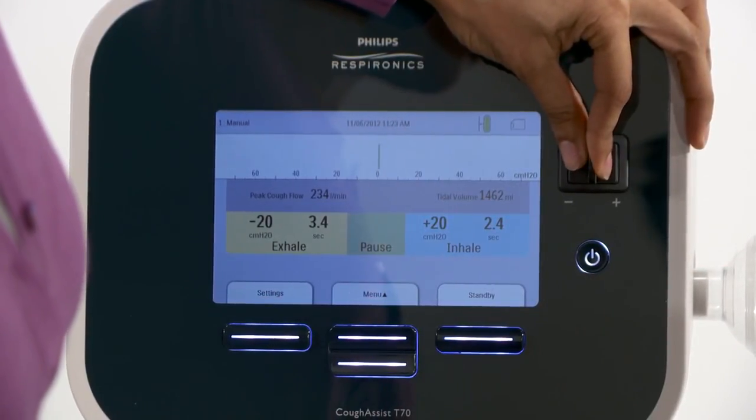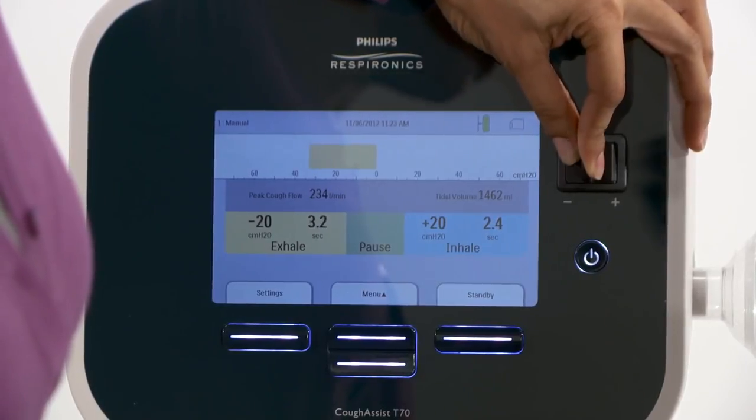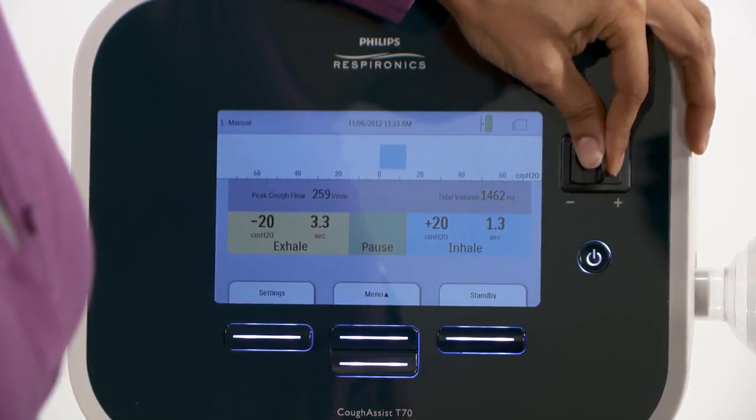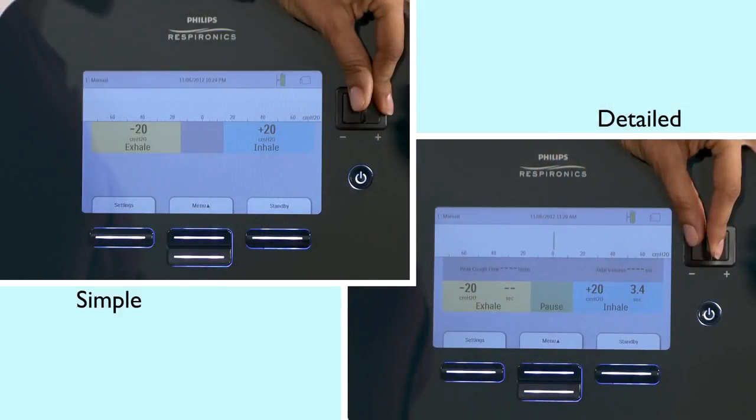Exhalation pressures appear on the left as negative numbers on the CoughAssist T70 screen. Inhalations are shown as positive. Both appear in real time. A simple screen view with less respiratory information is also available through menu options. The detailed screen provides additional clinical information.